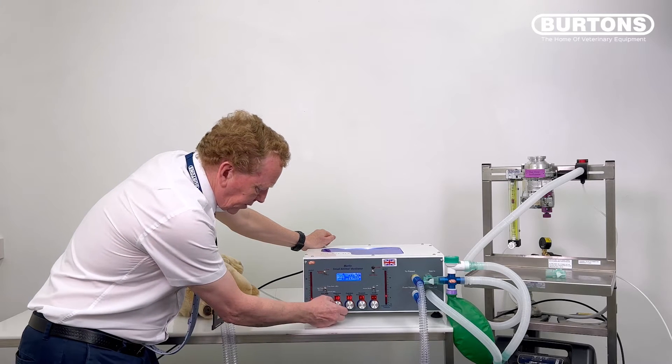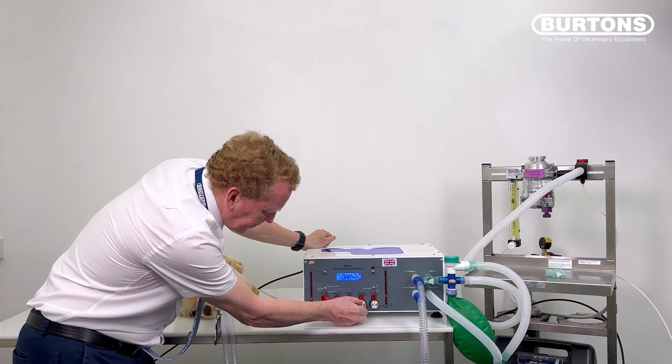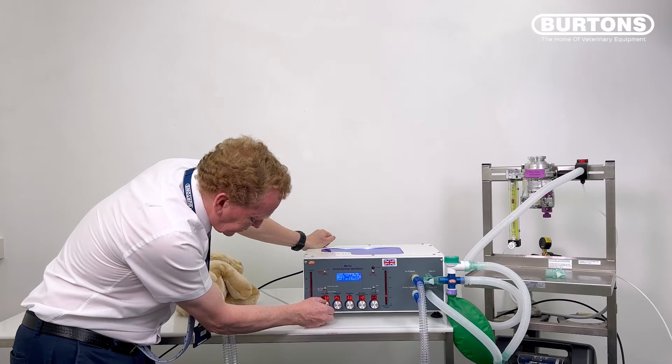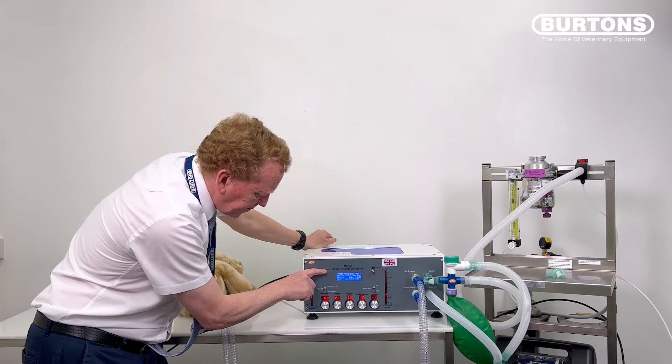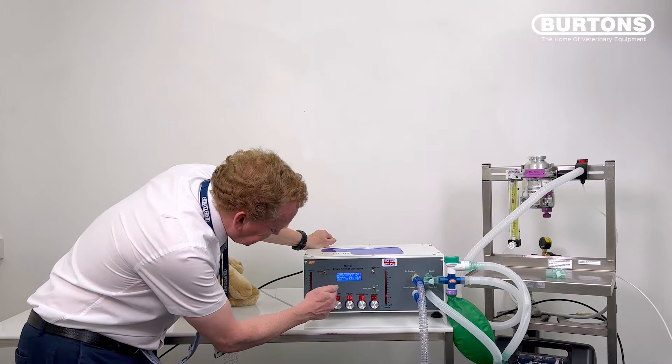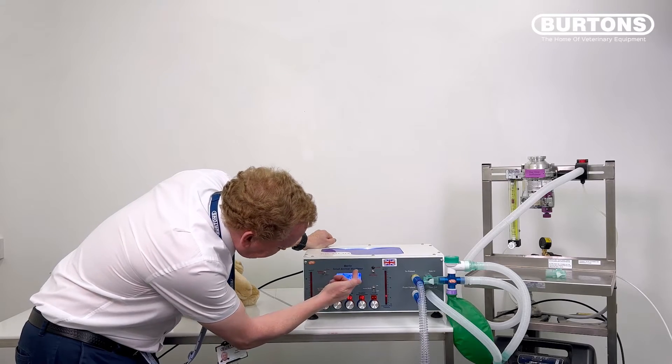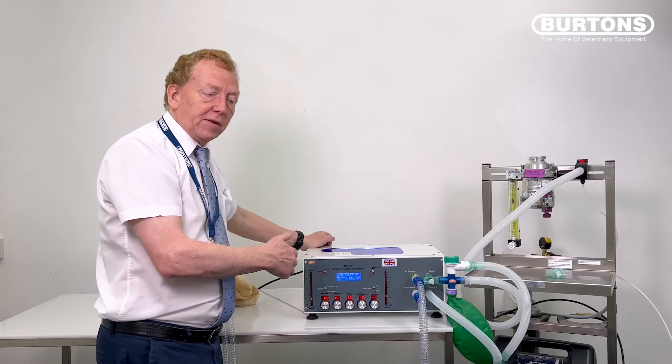So what I would do, I'll go to the pressure cycling mode. I'd set my target pressure to 10. I've got my flow to six as we just discussed. And I'm going to put that to run. Okay, now it's delivering to a pressure of 10 and the delivered volume is 19 mils or so. So we're basically doing exactly the same thing. That's pressure cycling.